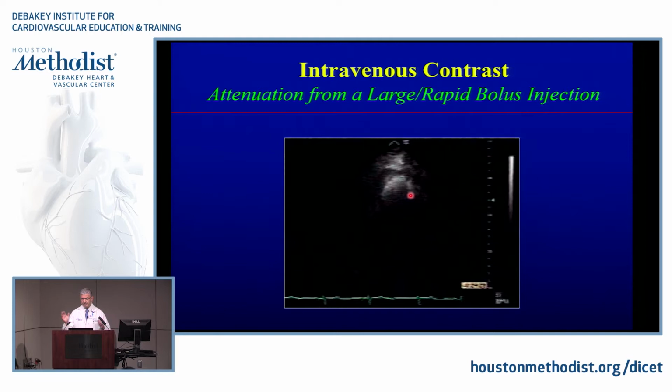Where were you, doctor? Dr. Cassie. Yes, indeed. The reason why you have blackness here is almost like if you put a metal sheet right here. The concentration of contrast is so high that it's reflecting all the ultrasound back. Nothing penetrates. I cannot see if I cannot penetrate with ultrasound for it to be reflected to come back. Right?